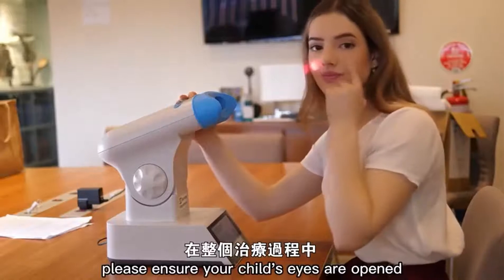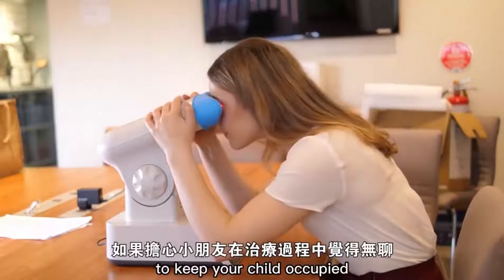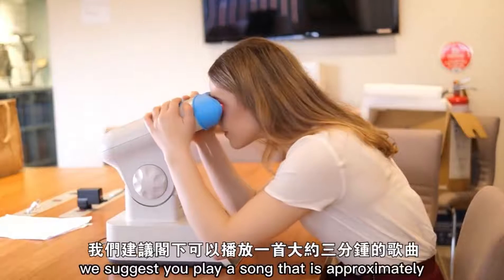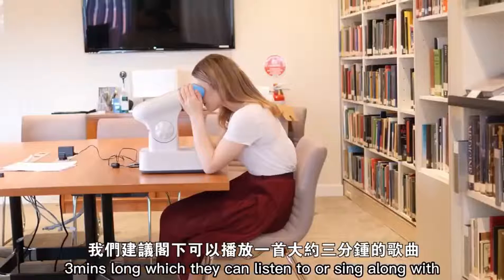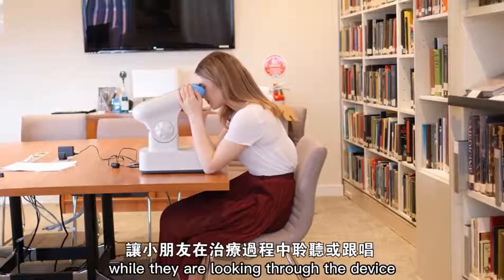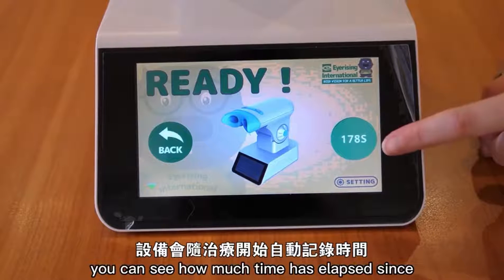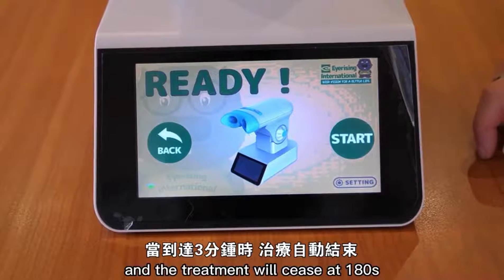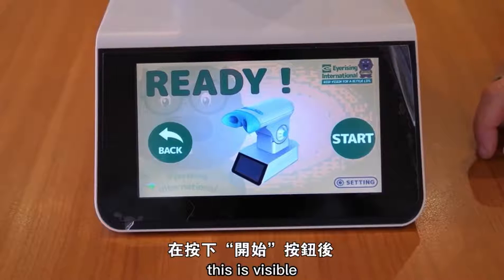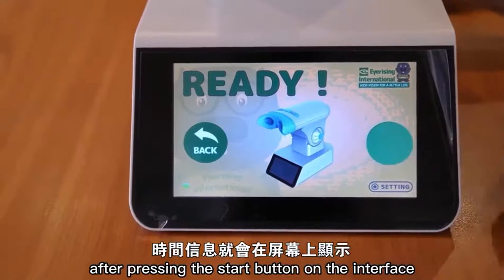Please ensure your child's eyes are open during the entire treatment. To keep your child occupied, we suggest you play a song that is approximately three minutes long, which they can listen to or sing along with while they are looking through the device. On the device, you can see how much time has elapsed since starting the treatment, and the treatment will cease at 180 seconds. This is visible on the display screen after pressing the start button on the interface.